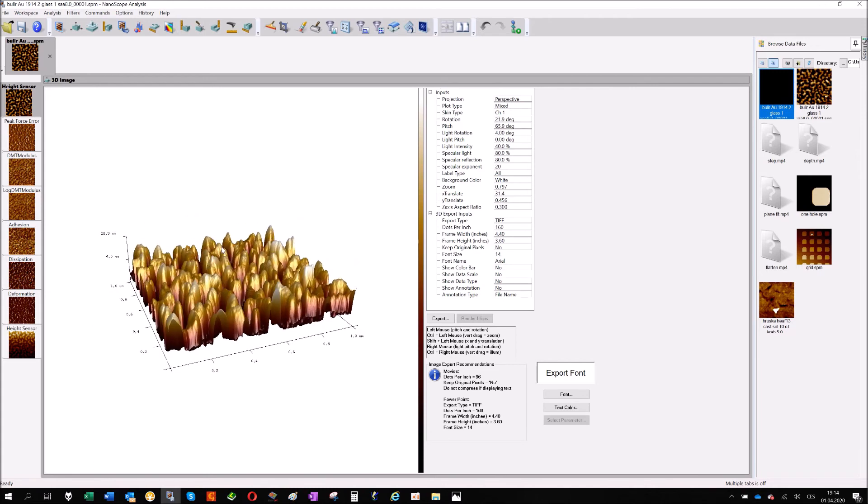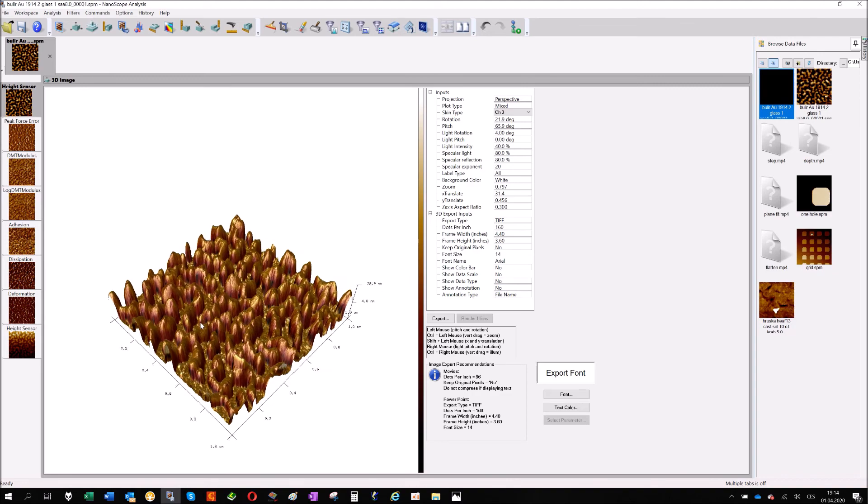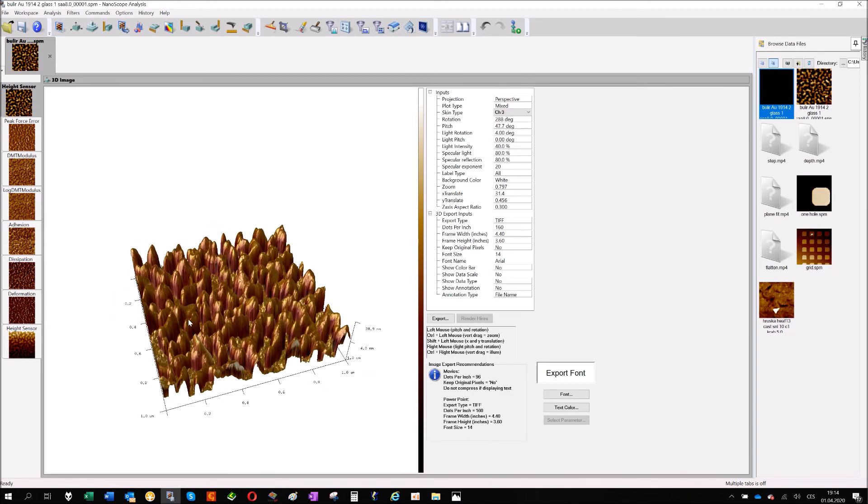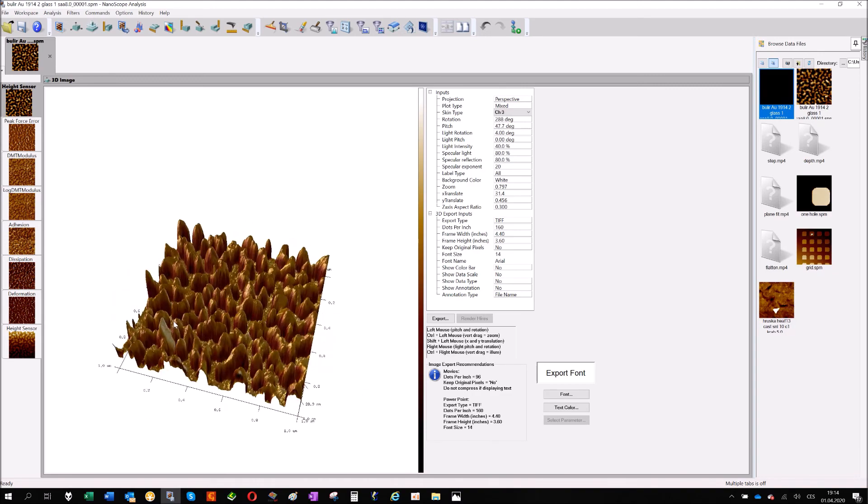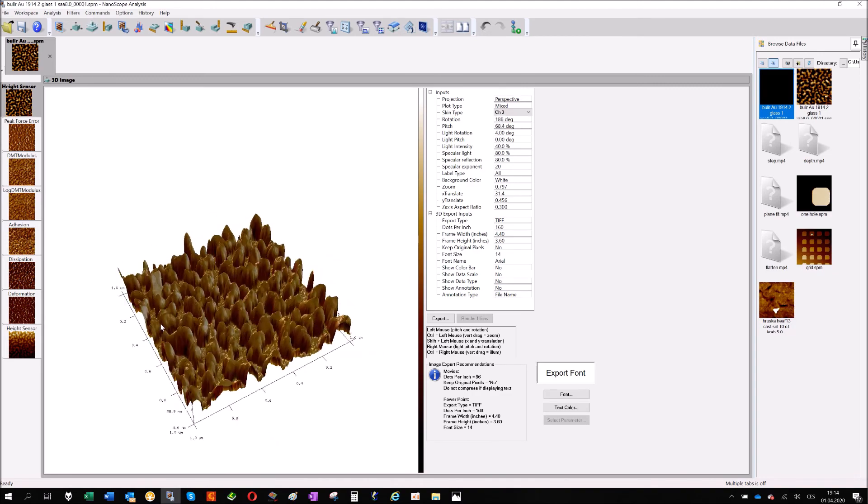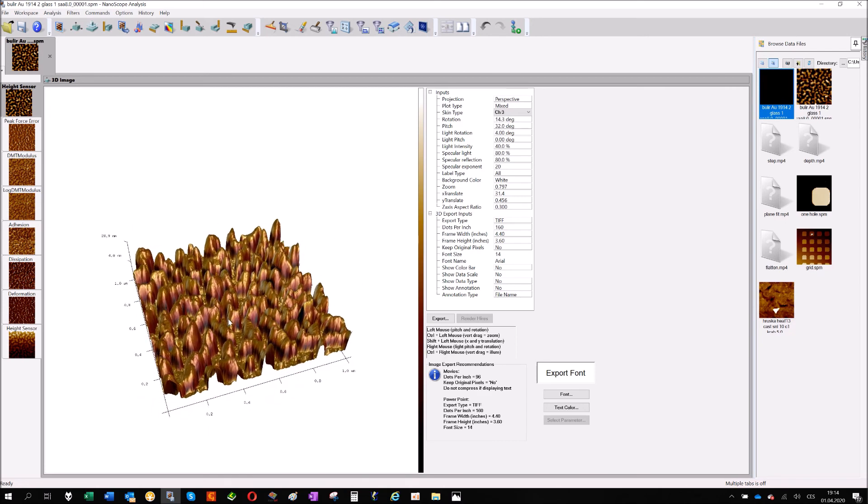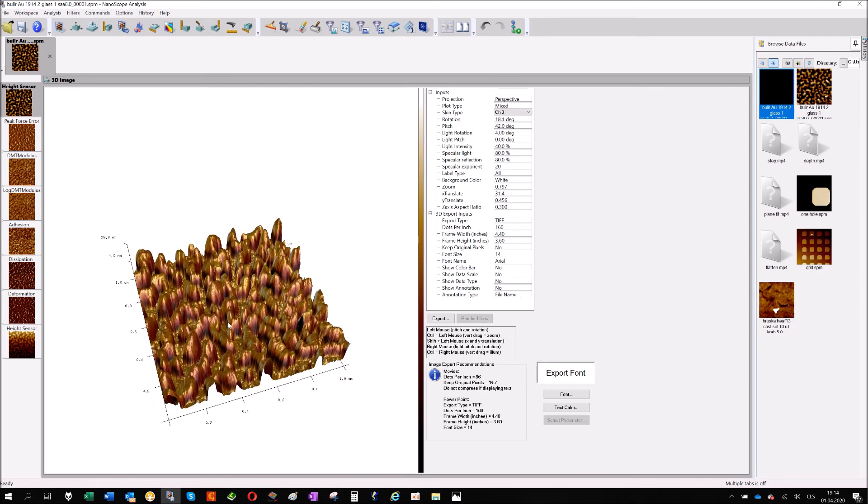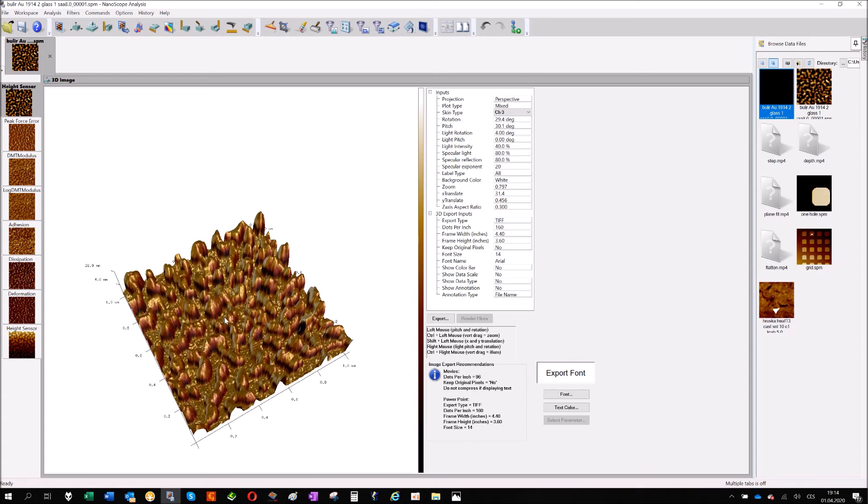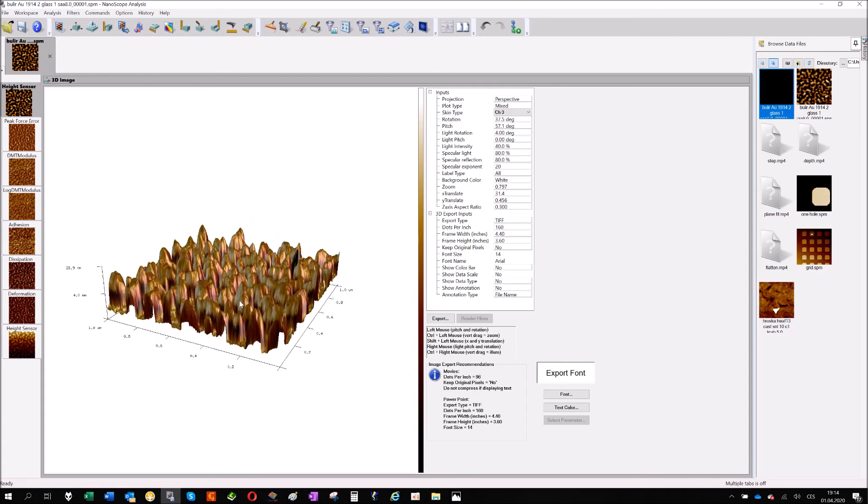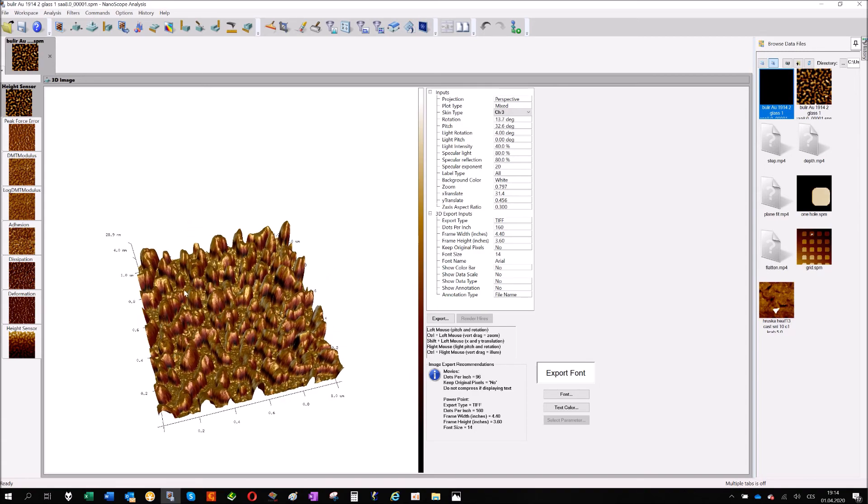A 3D map based on the information from height sensor, and you can plot a channel. This one is channel three. You can plot information from a different channel, so you have information from two different channels at the same time.